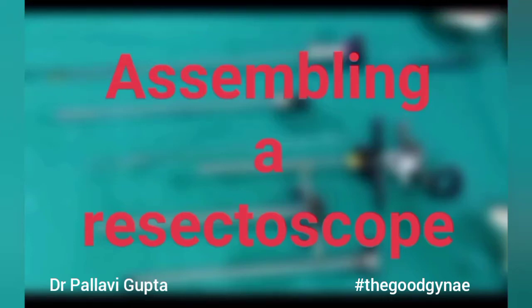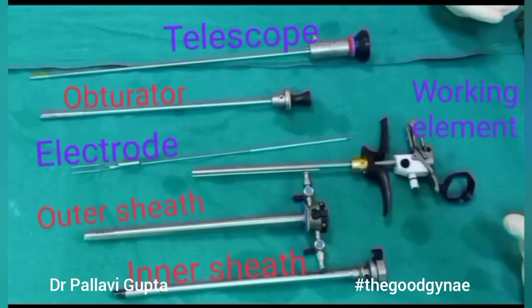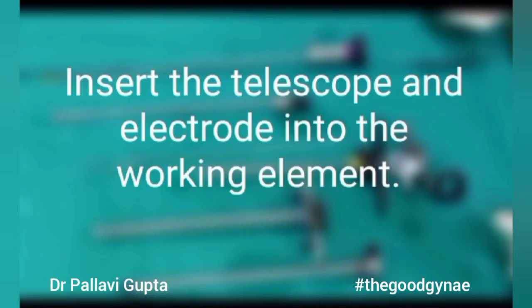Today we are going to learn how to assemble a resectoscope. These are the different parts of a resectoscope. First we are going to work with the telescope, electrode, and working element.